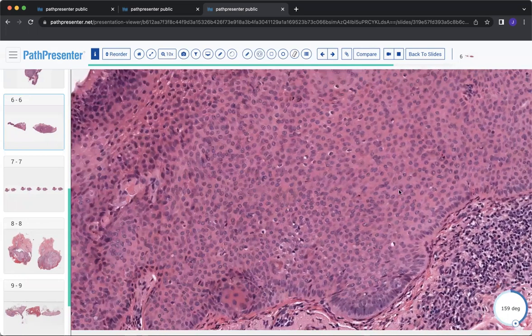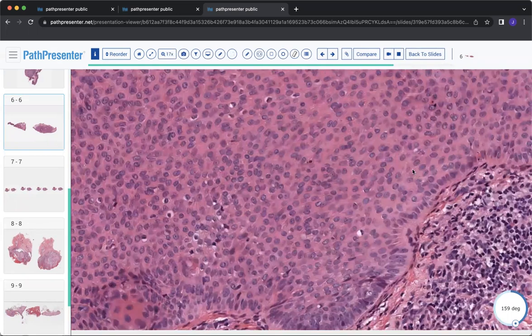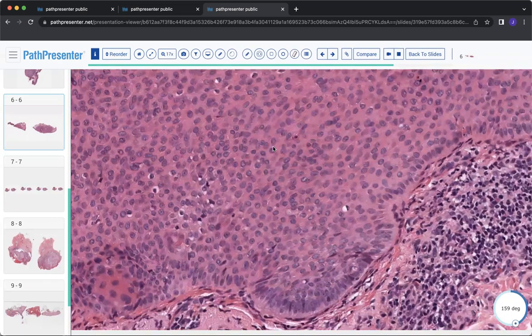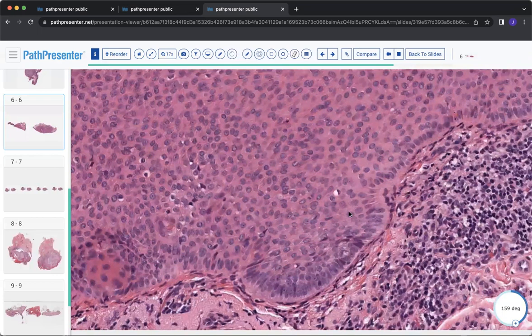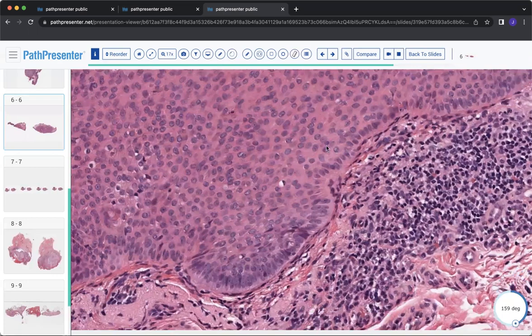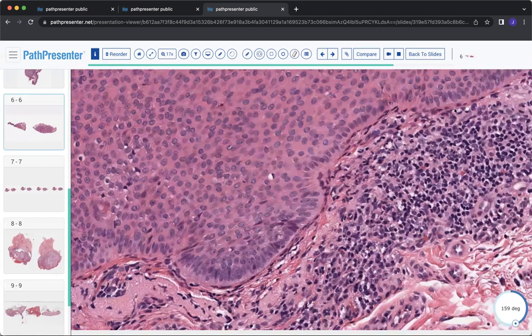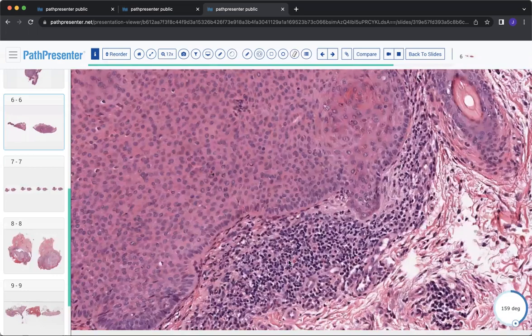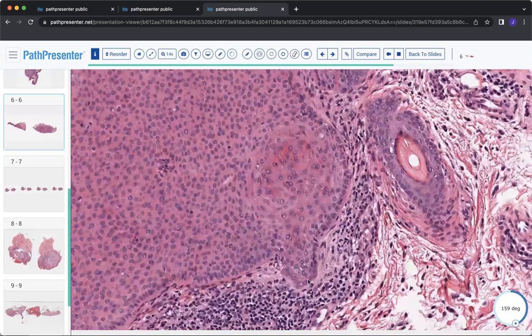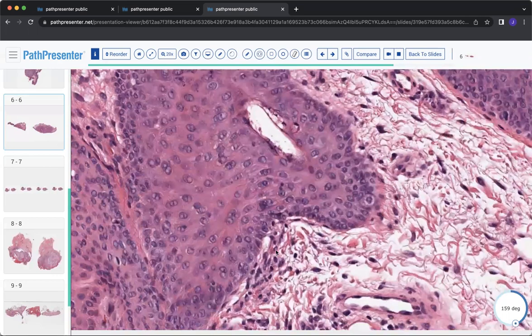So in contrast to, say, a basal cell carcinoma, where you'd expect to see a ton of cellular atypia throughout here, more mitotic activity, here the cells are very monotonous. And you do see this area of peripheral palisading, which could bring up the idea, oh, are we dealing with a basal cell? But hopefully you'll notice this area of well-organized eosinophilic material along the rim. And so that will put you in that category of a tricholemmoma again. Just to show you an example of that tricholemmoma.